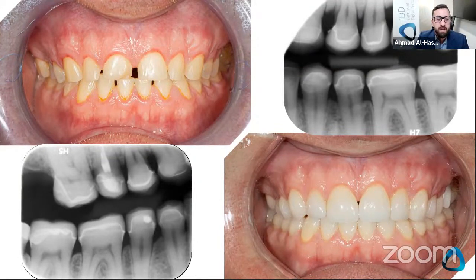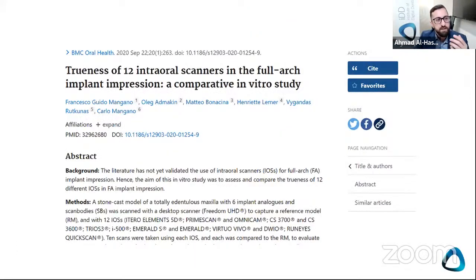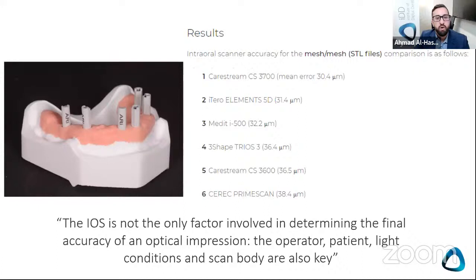And so if you look at these x-rays, a lot of these margins, I'm sure any of us would be happy with that. And so definitely the accuracy is there. That's no argument anymore. The other thing is we're getting more and more research about the trueness between scanners. And so this research looked at basically full arch scans and which scanners gave the best results.